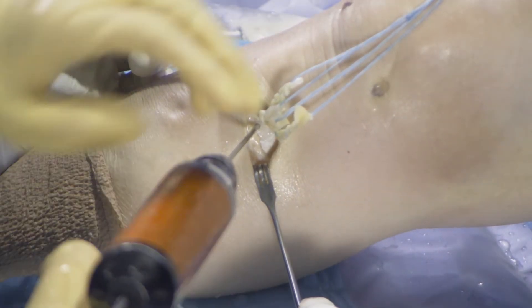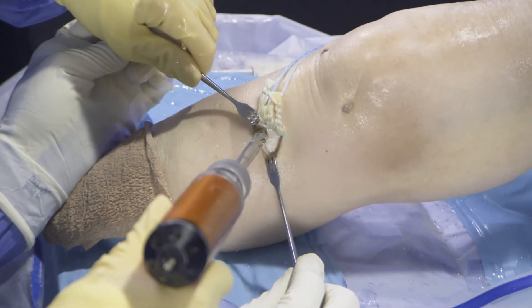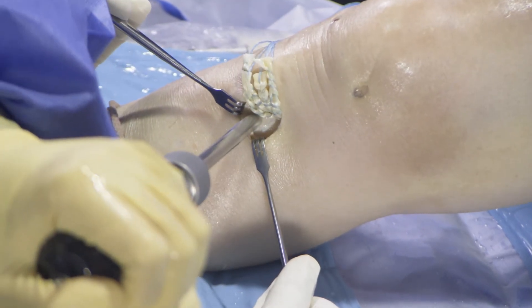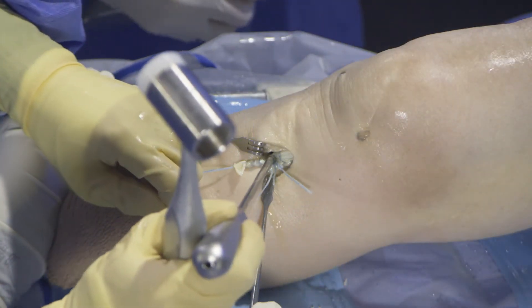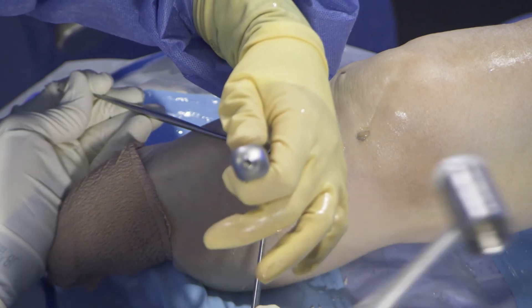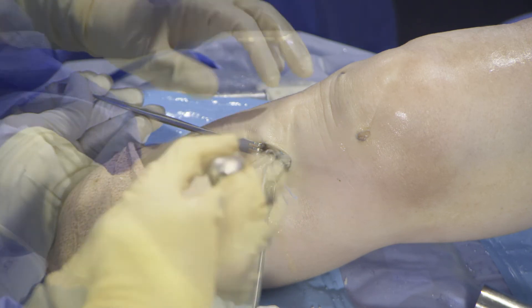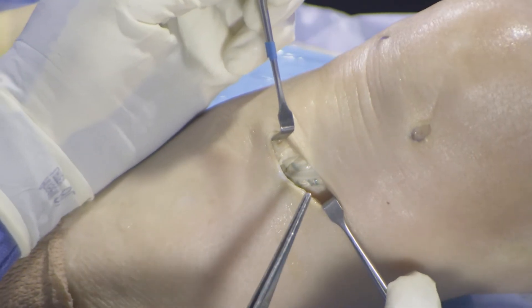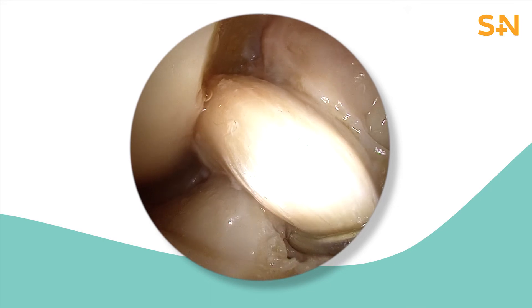For soft tissue grafts, I choose to secure the distal ends with backup fixation in a tenodesis fashion using a BioSure peak screw. A 9 mm unicortical socket is made perpendicular to the tibia. This pitchfork is then used to place the tendon ends into the socket under tension, and finally secured with an 8 x 25 BioSure peak screw. The tendon ends are now secured.